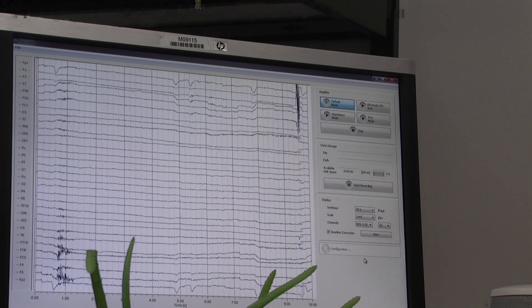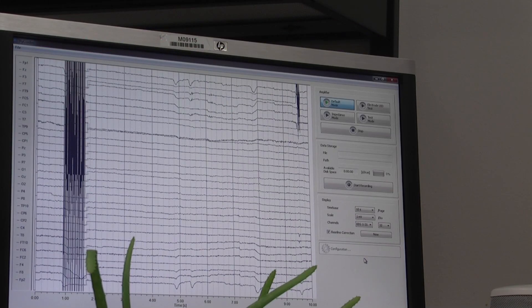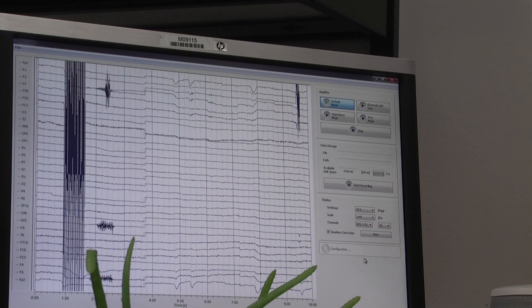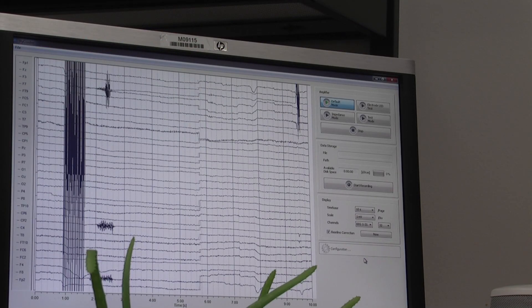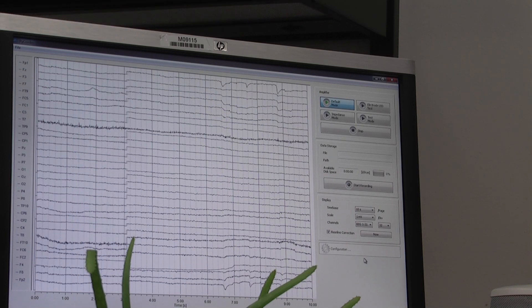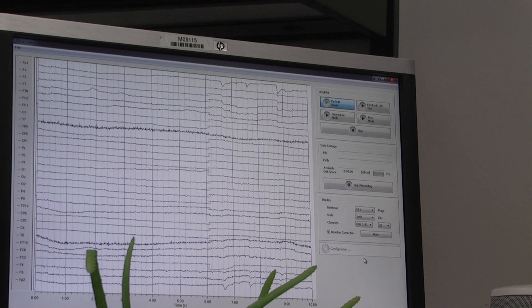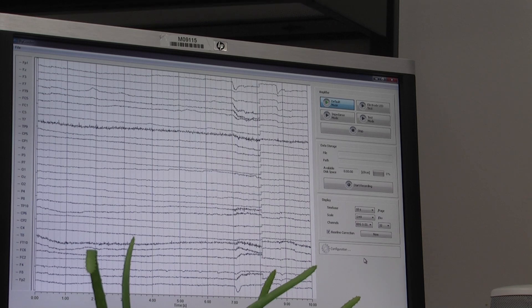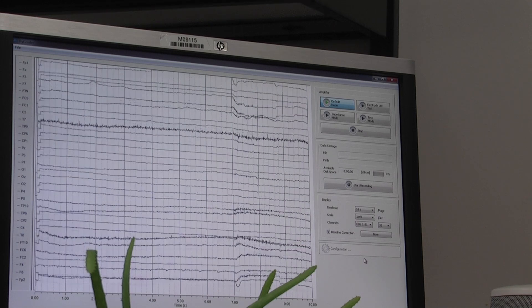So the other thing that I want you to do now is here. Let's let this reset. And then I'm going to have you talk. I'm going to have you say something. So go ahead and ask her some questions. Allie, what is your favorite color? Blue.